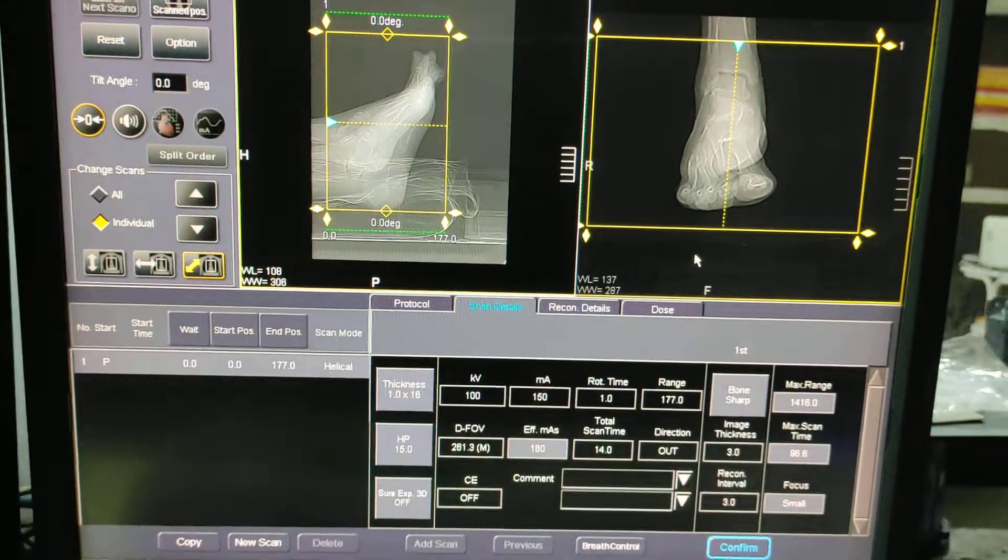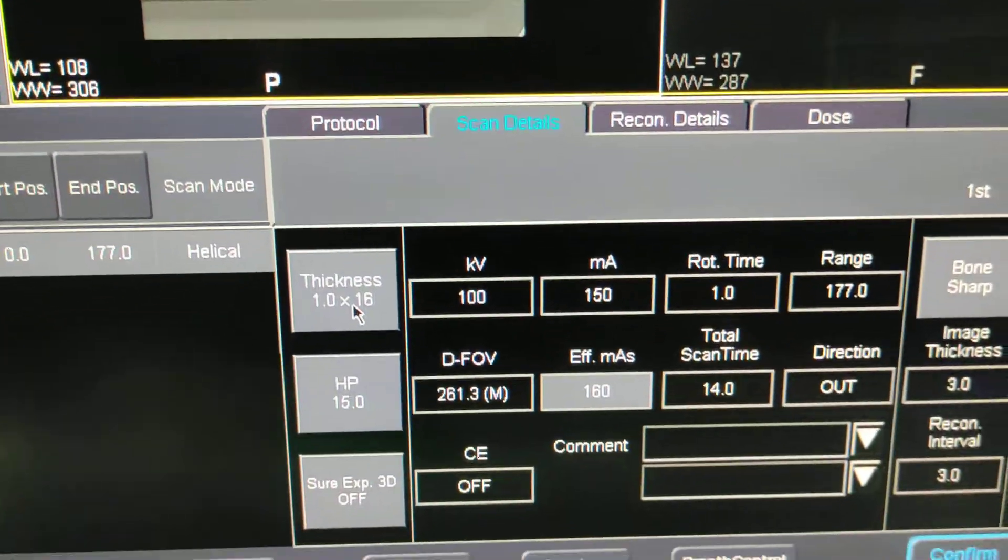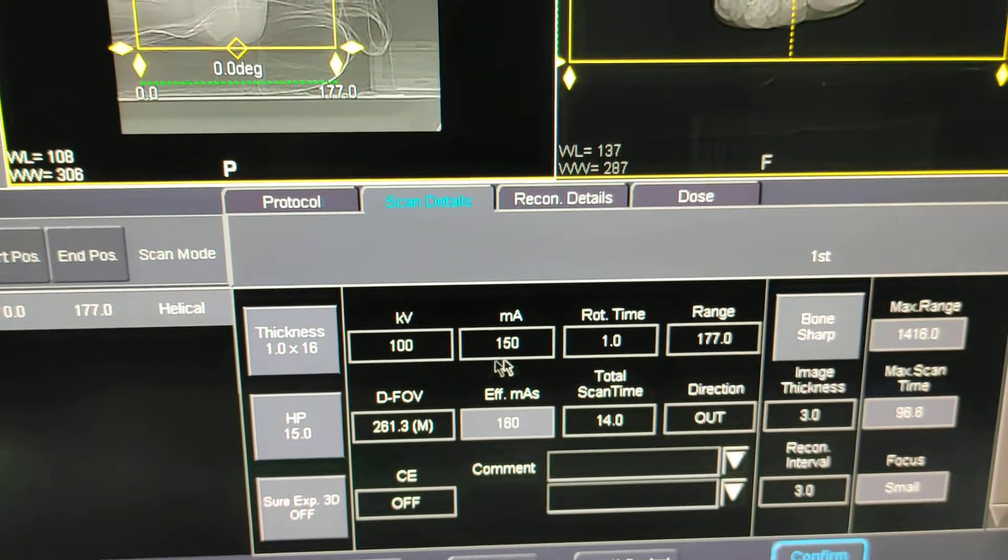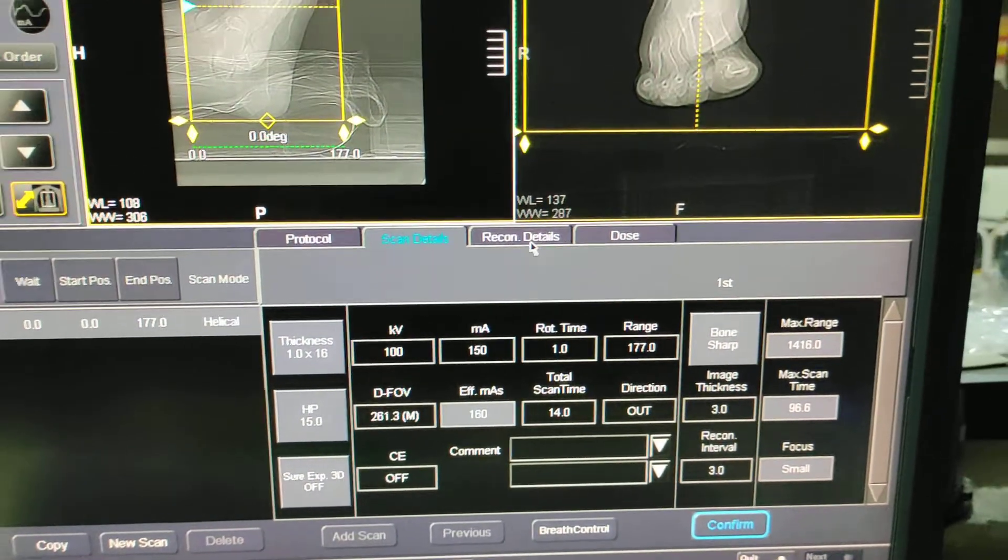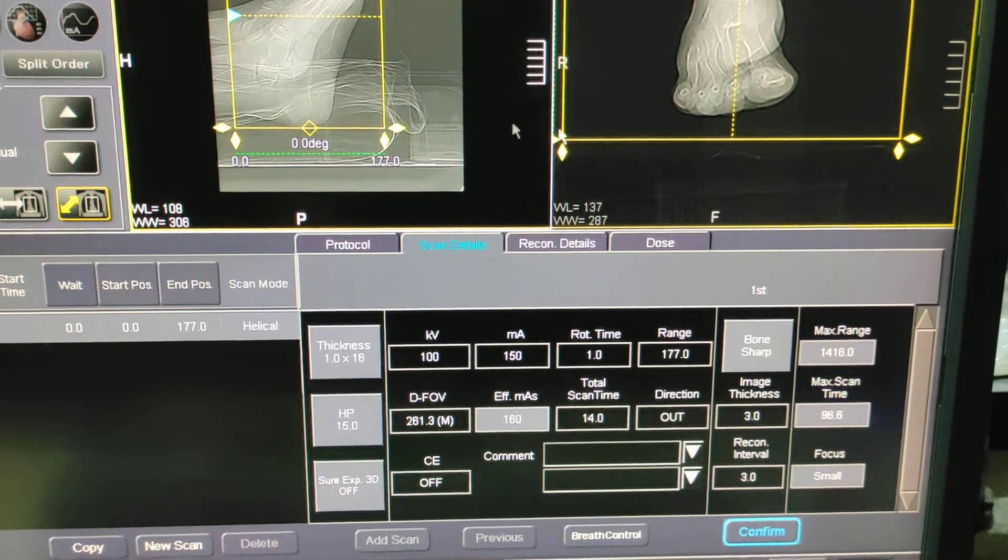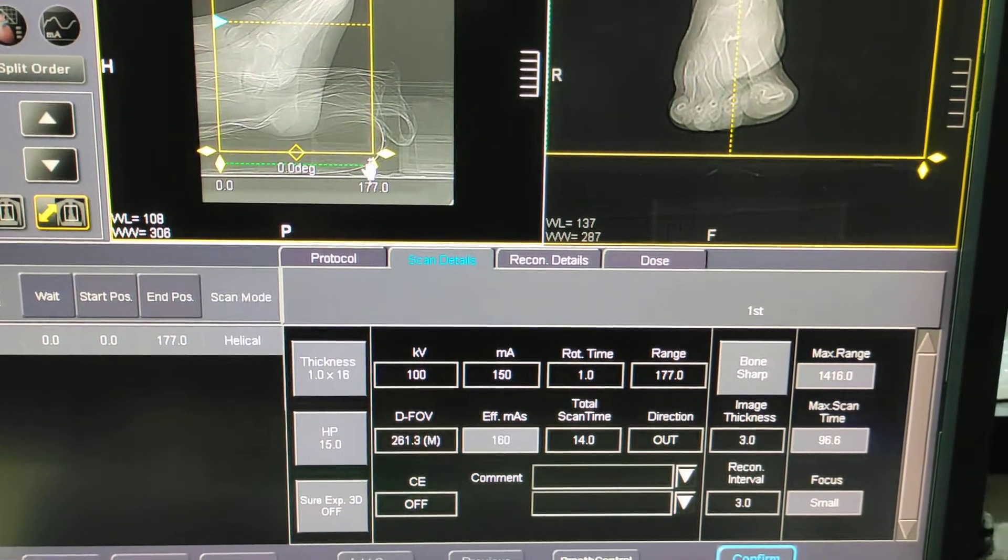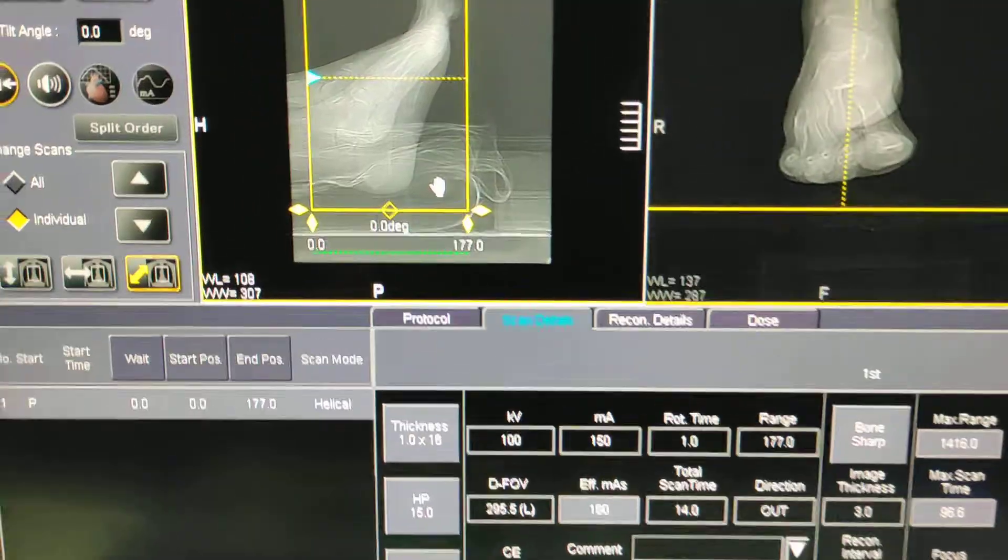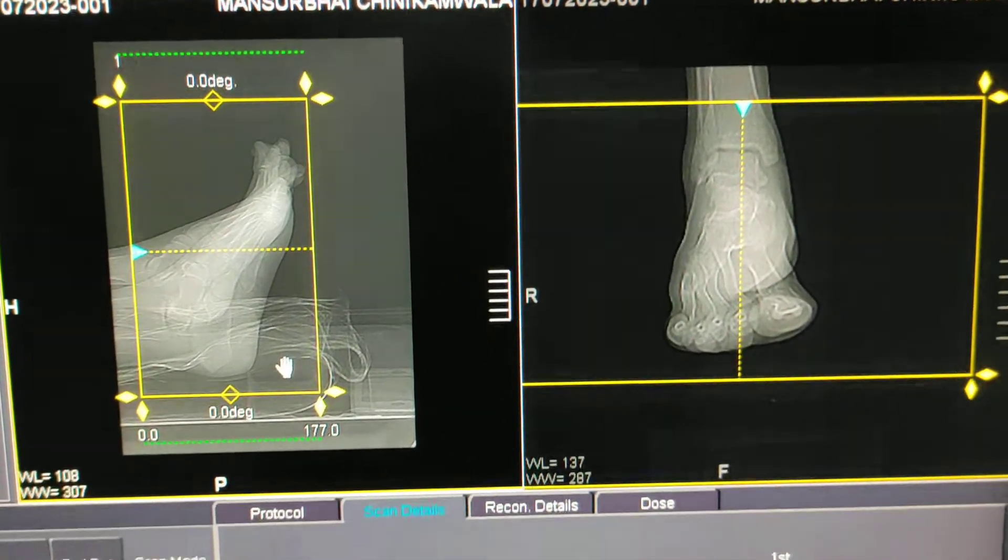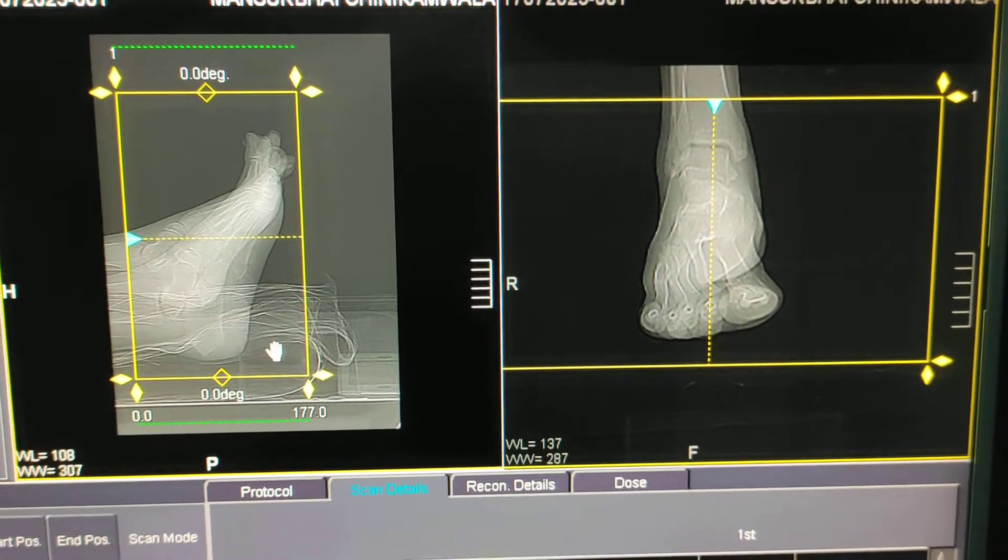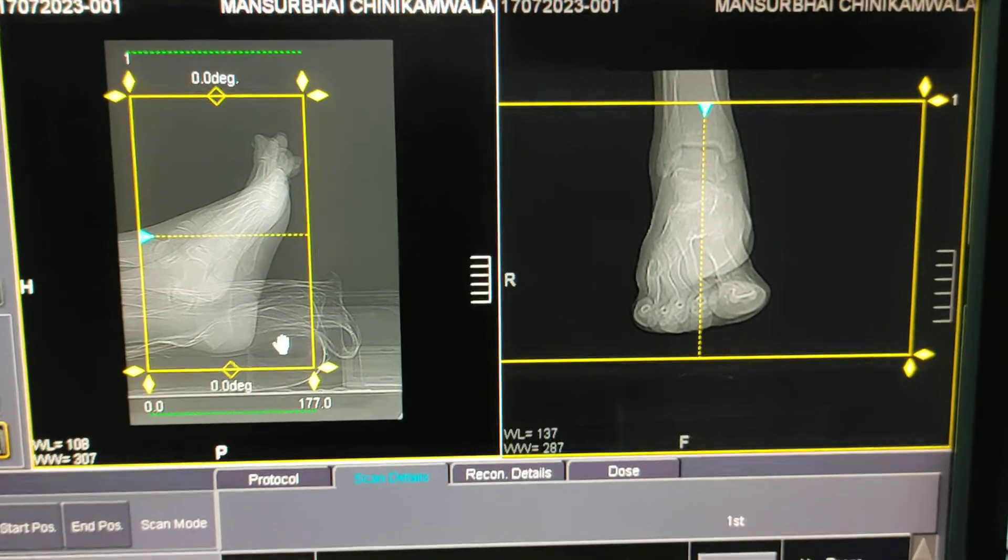Before starting the scan, you have to check the FOV is 150. Afterwards we will change the recons. Before starting scan, you have to check the FOV properly so that images should not cut.